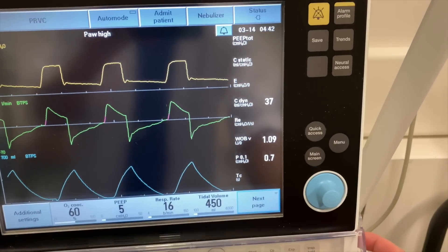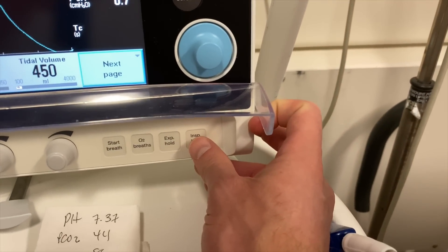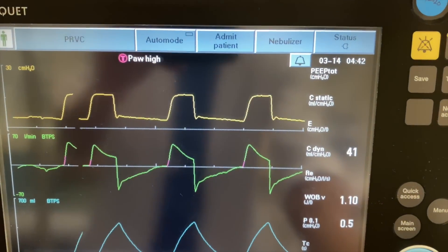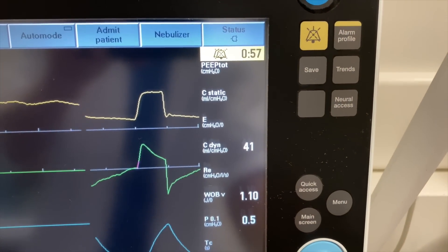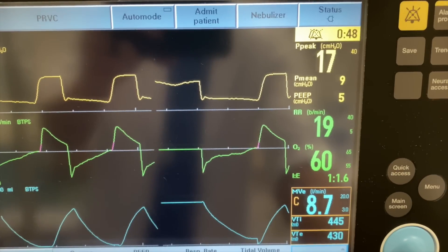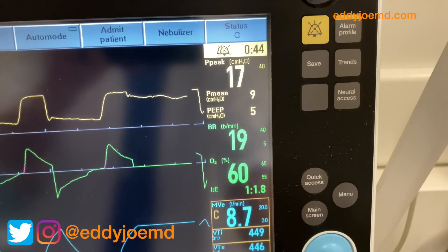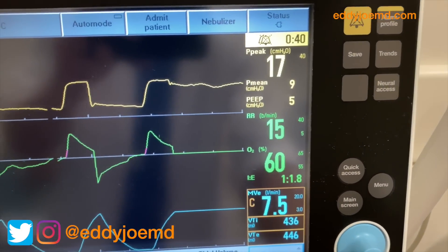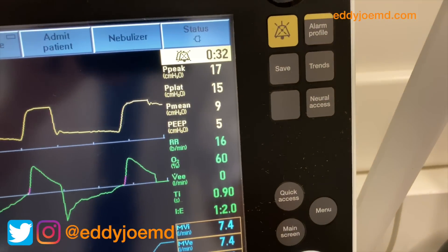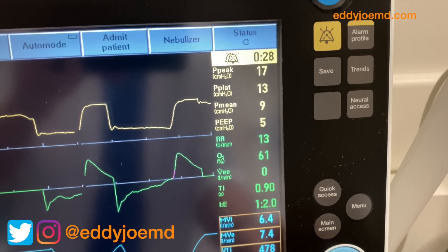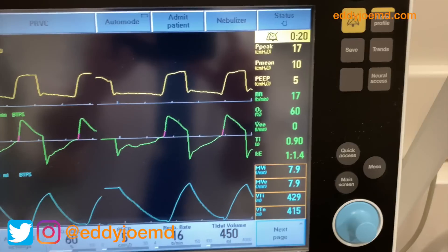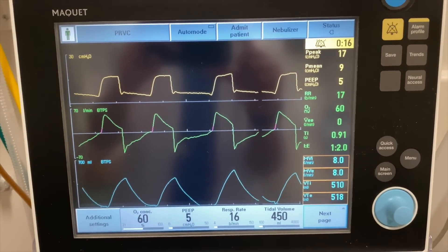If you want to go ahead and check a plateau pressure, which is basically where you're doing an inspiratory hold — you see the button that says inspiratory hold. You go ahead and wait till the patient inhales. You see a plateau pressure of 14 or so. In patients who have ARDS or severe lung disease, you want that to be less than 30. And that's a simple ventilator talk, guys. Hope you all enjoyed it.